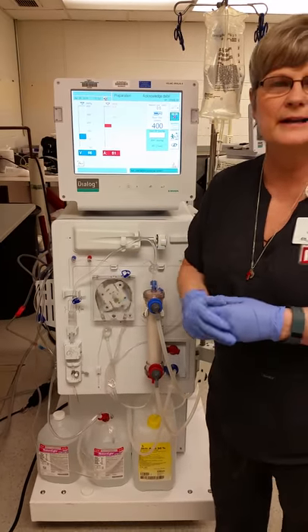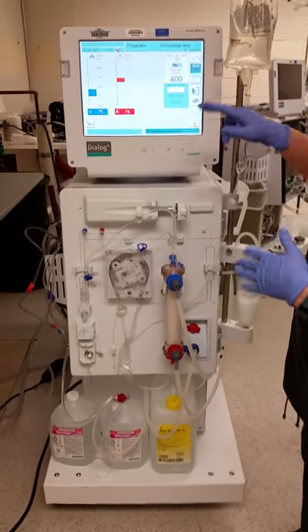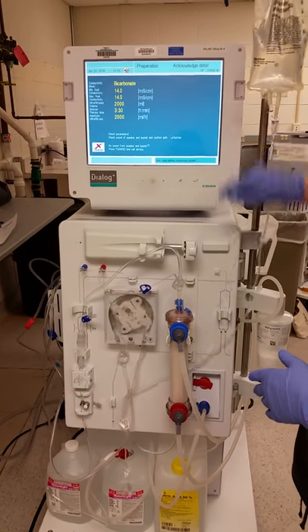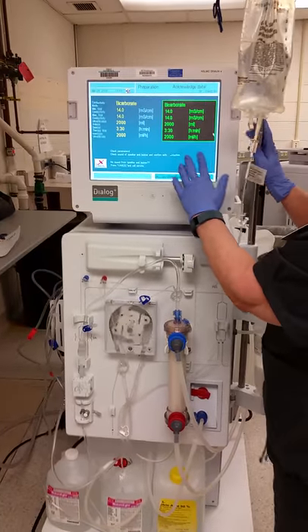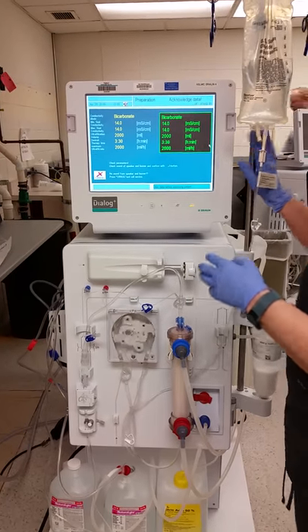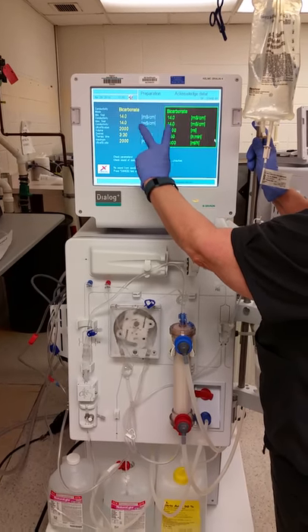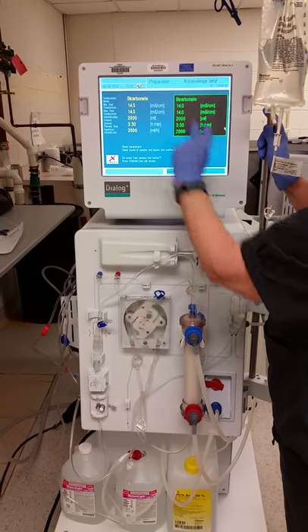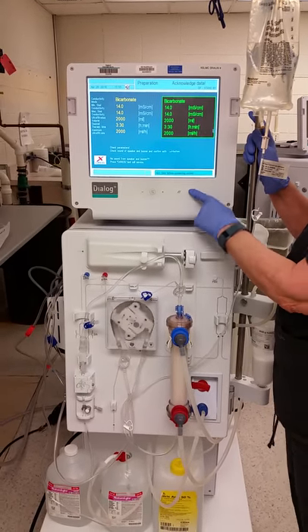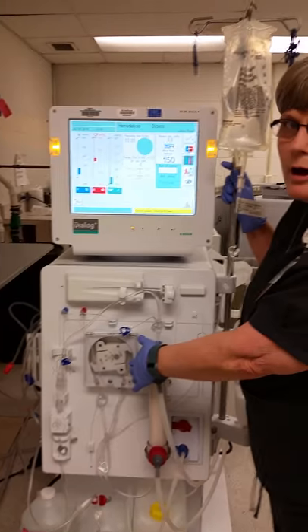We are going to use a bucket as our patient for today. The first thing you want to do is acknowledge the patient data by pressing the green man — press the green to go. You will get a screen where you can verify your orders: the correct volume for removal, the correct time, your final conductivity, and the min and max values should be matching. Once you have acknowledged this information, press the confirm button.